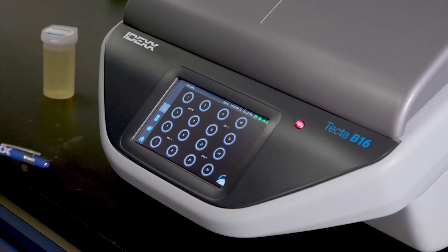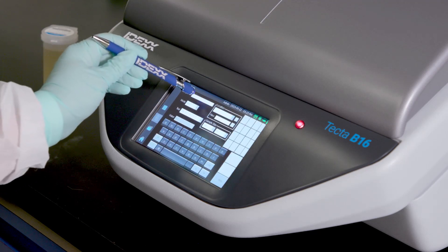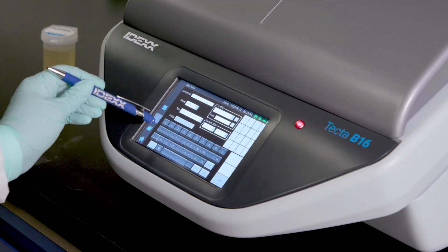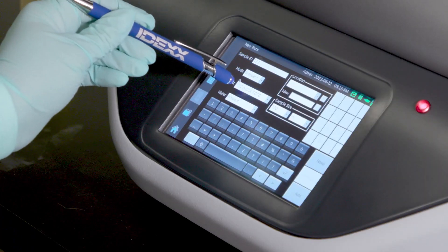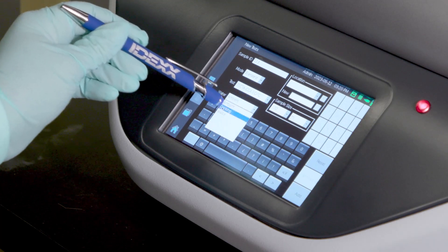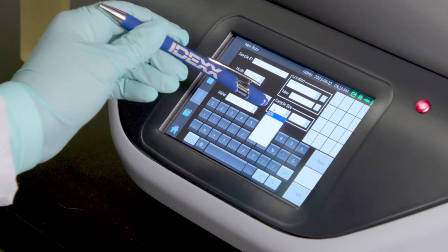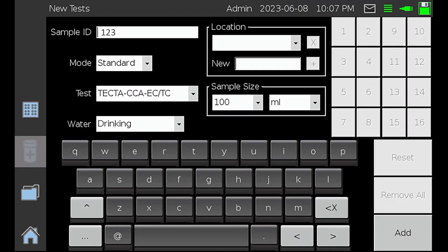To initiate a new test on your TECTA instrument, select the New Tests icon on the left side of the screen. Next, enter your sample ID in the text box. Details about the sample can be recorded in the Test Details screen. In this example, we will select standard mode, TECTA ECTC, drinking water, and 100 ml sample.